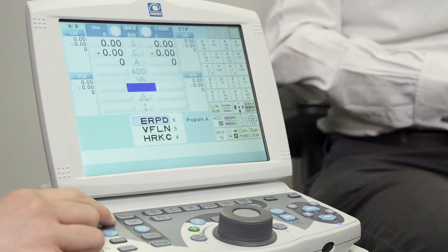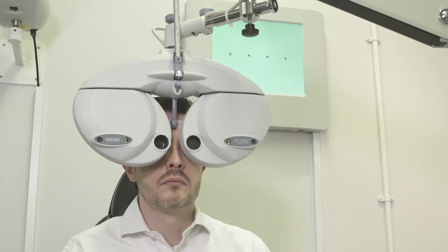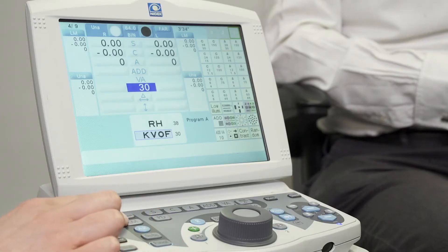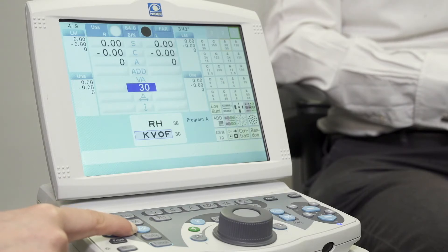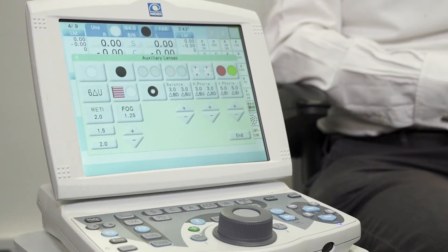Running through a quick routine, I start off by occluding over the left eye. Once we've done that, we can then move on to the lens meter data or our autorefractor data if we've inputted it from another device, or you may choose to do retinoscopy at this point. If so, click on the lens just here and we've got our retinoscopy working distance lenses here.